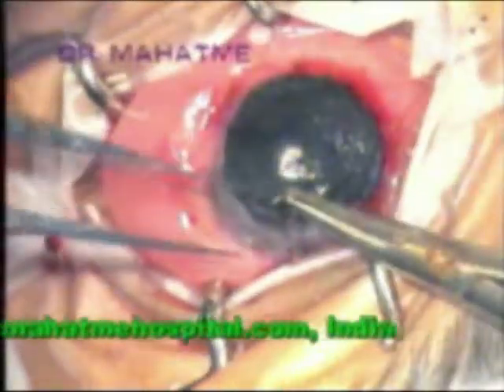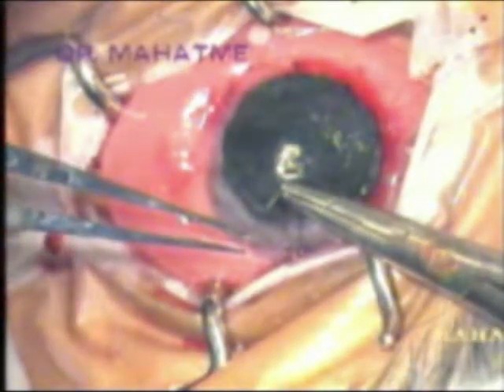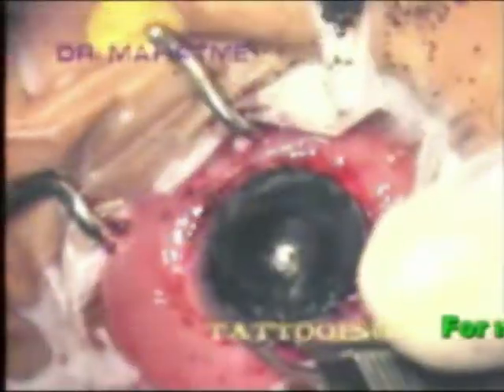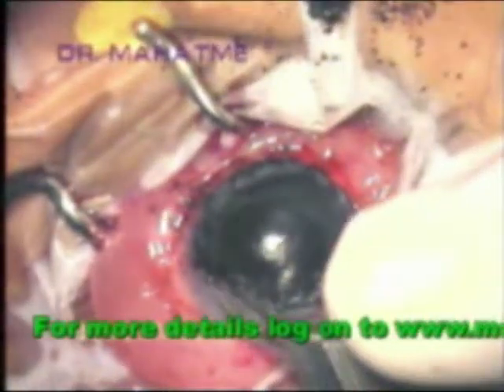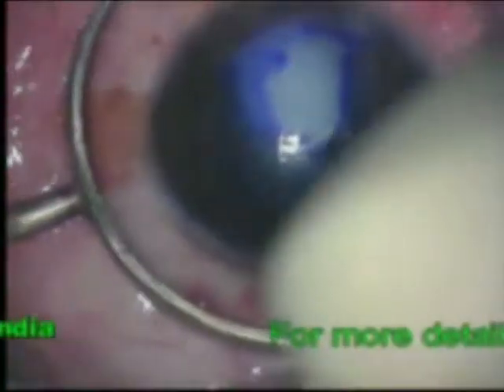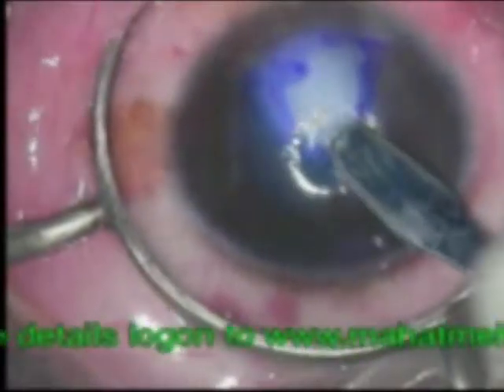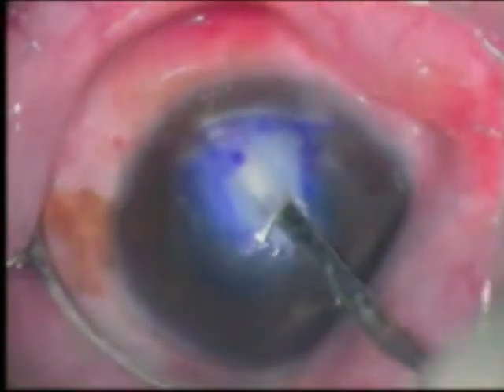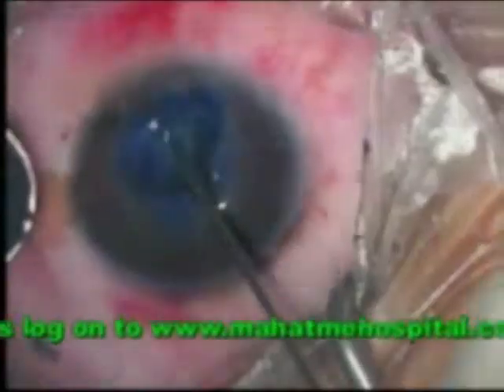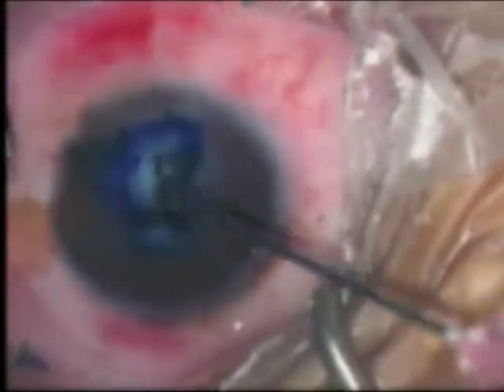Once this is done, suturing is performed using 9-0 nylon suture. But before tying the knots, the tattooing pigment is first spread between the graft and the recipient bed, and then knots are tied. If the cornea has multiple forms of opacities, like central dense and peripheral nebular superficial opacity, then a combination of procedures can be adopted. The central dense opacity can be tattooed using lamellar dissection and the peripheral superficial opacity can be tattooed using the multiple needle puncture technique.